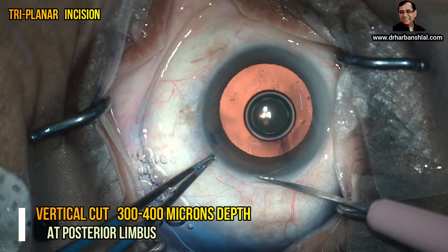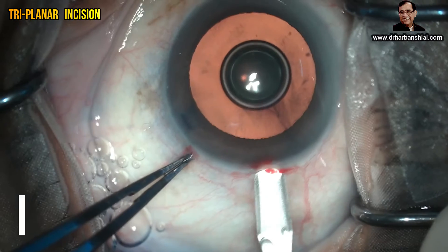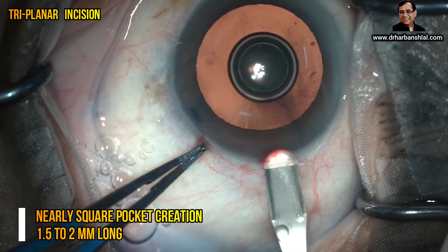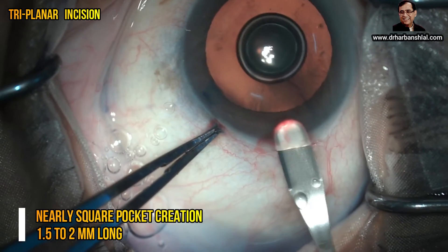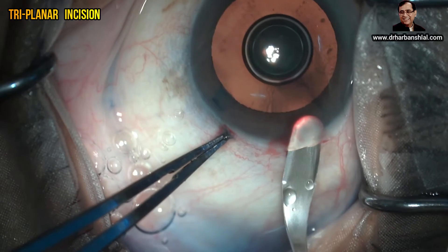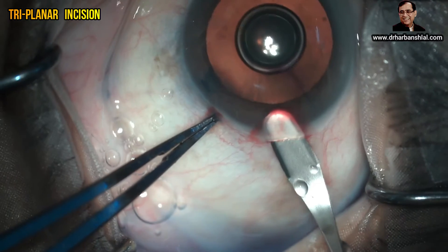The straight cut has to be three to four hundred microns deep. After making this cut, check whether it is deep enough or not. Then take a crescent knife and start making the pocket three to four hundred microns deep. The inner pocket has to be as wide as the outer pocket. Because of the curvature of the crescent knife, we need to tilt it to the right and to the left to achieve a good wide pocket in the central part.